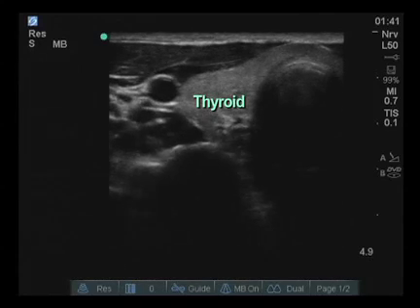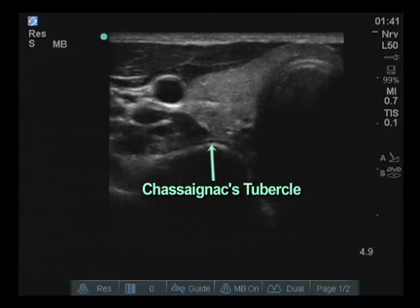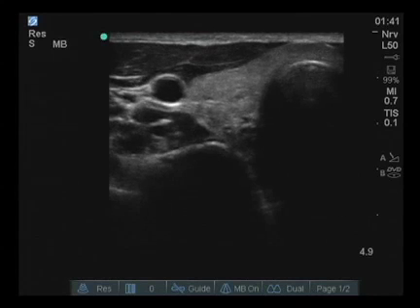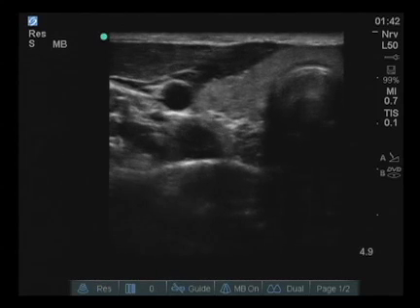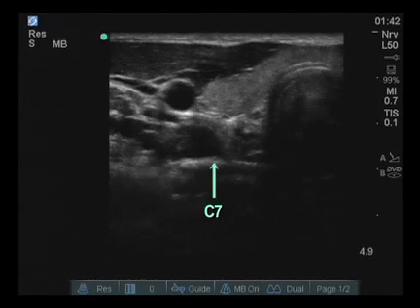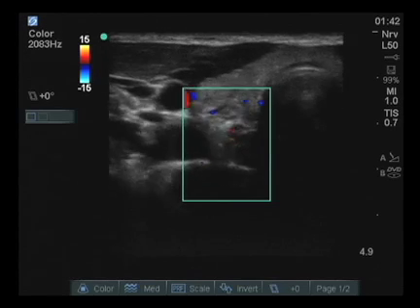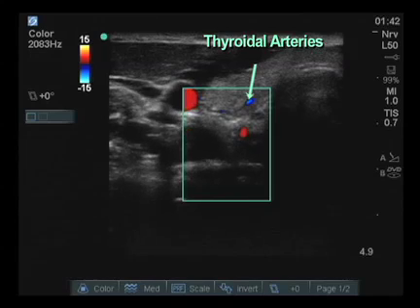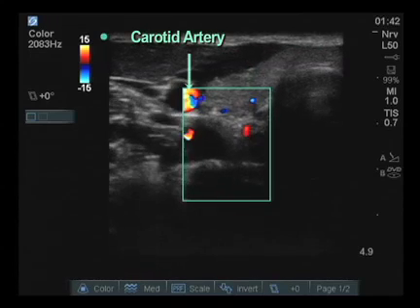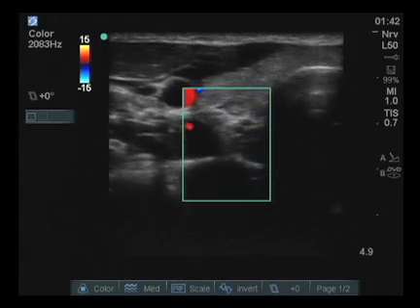At this point, the thyroid as well as the carotid artery and Chasniac's tubercle are clearly visible as the hump located immediately in the center of the screen. Since this is the C6 tubercle, we will move slightly inferior until it flattens out and this becomes the C7 transverse process. It's important to utilize the color flow Doppler, which will indicate vascular structures such as perforating thyroidal arteries, the carotid artery, and the vertebral artery more laterally. The structure of interest is the longus colli muscle.